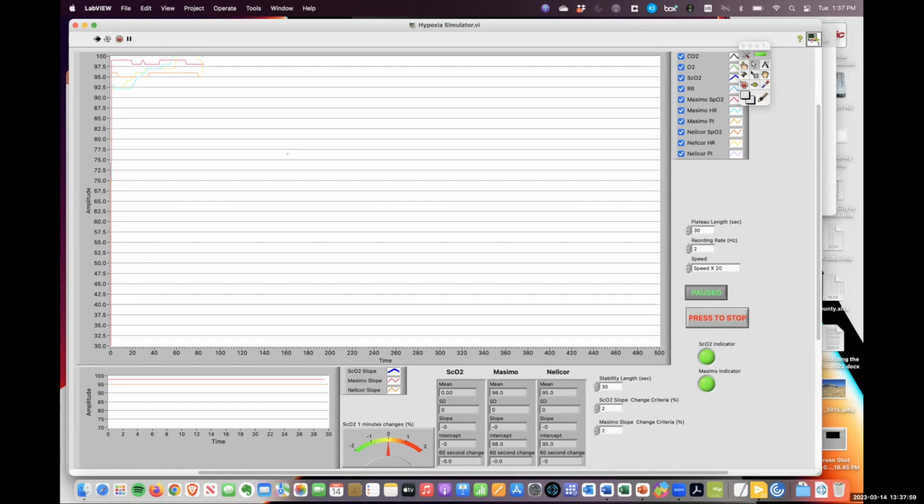As Paul mentioned, one of the key goals here is the stability of the desaturation. The technique that Severinghaus developed for testing was based on the idea that if the plateau is perfectly stable, then any uncertainty between the pulse oximeter and the blood draw goes away. And that's the key thing, the whole issue of timing. Perfect plateau means that timing uncertainty is decreased.